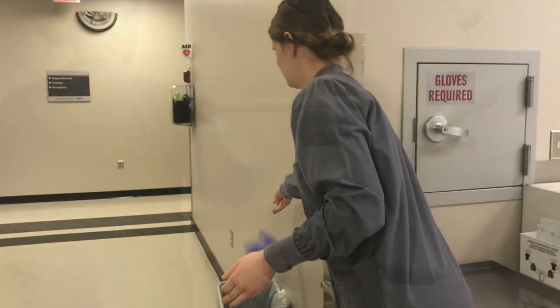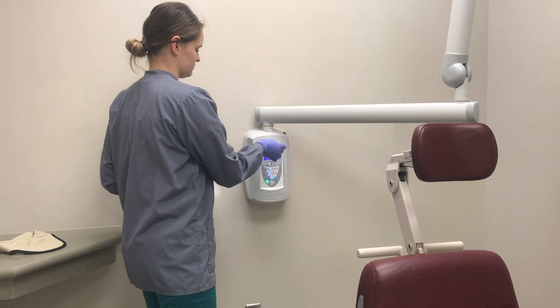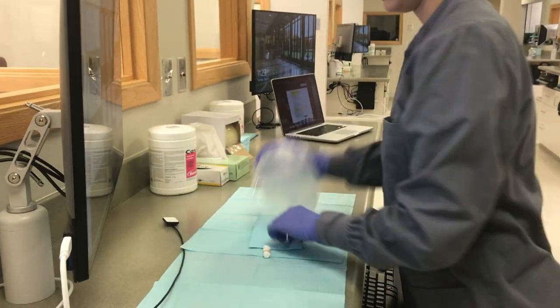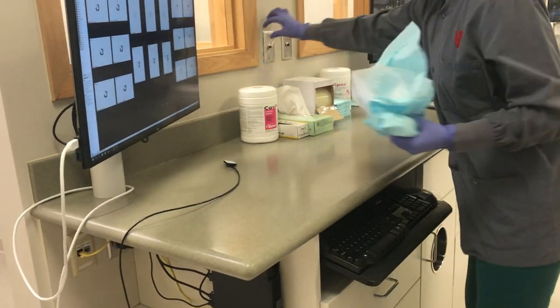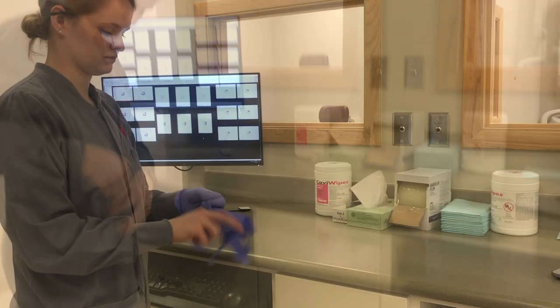Don new gloves before re-entering the unit. Throw away the bag and barrier tape on the control panel, along with the blue napkins, plastic sleeve from the sensor, and barrier tape from the exposure button. Throw away your contaminated gloves and don new ones.